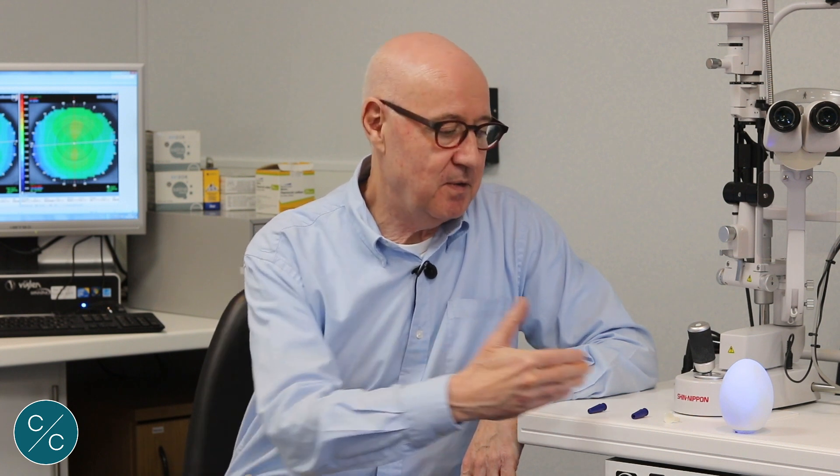Welcome to another Contacts with Conway. Having just seen the video showing the insertion and removal techniques for scleral lenses, I thought I would just introduce you to some variations on the traditional method.